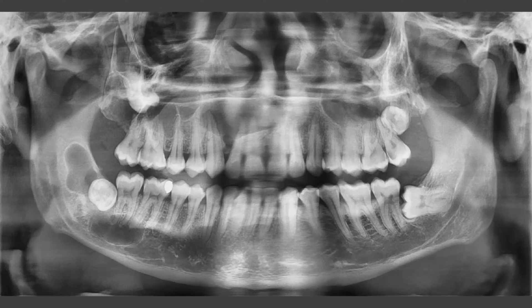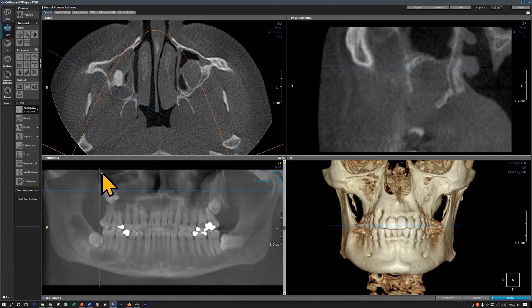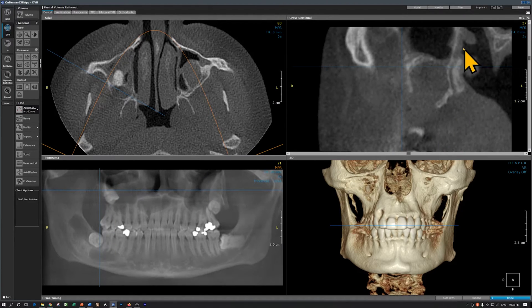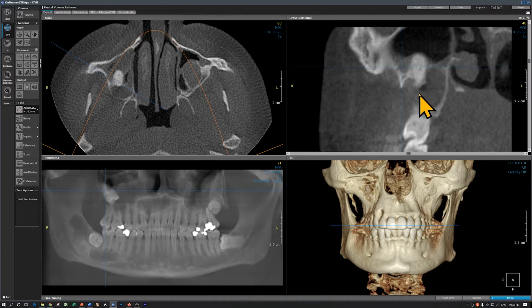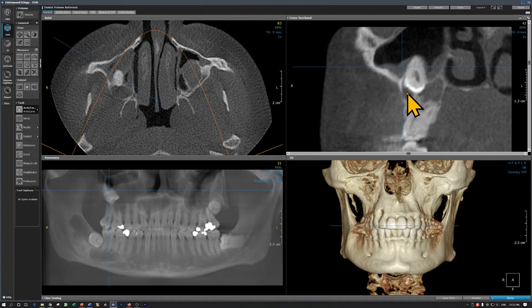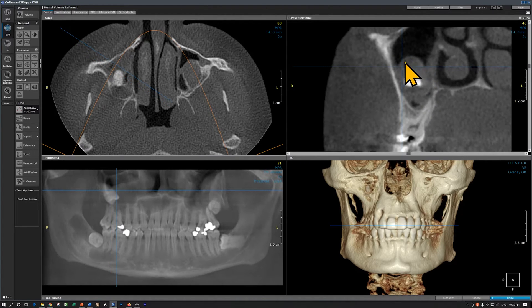Let's go to the CBCT scan. I'm using on-demand 3D software. This blue vertical line represents the image on this screen. I'm on the distal aspect of the maxillary right third molar and you can see the odontogenic keratocyst. I'm going to scroll through this very slowly. Coming mesially, this is the third molar and you can see the odontogenic keratocyst. The third molar crown is superior to the root of the second molar, and here is the odontogenic keratocyst extending into the maxillary sinus.